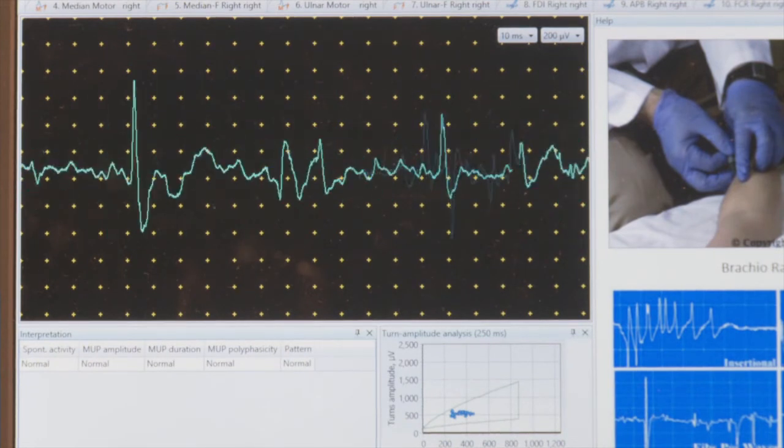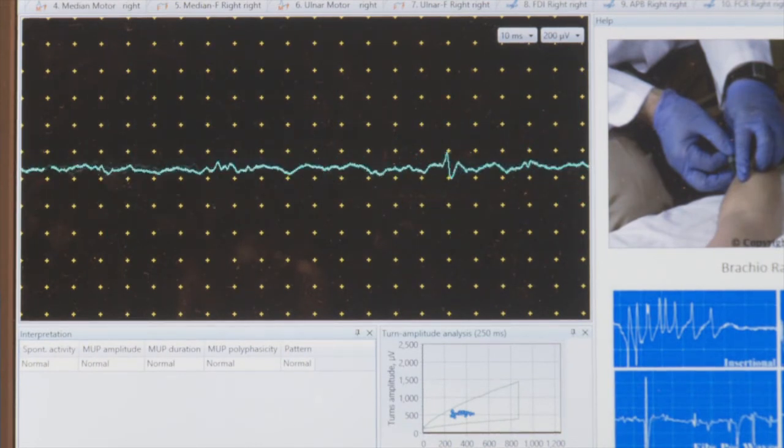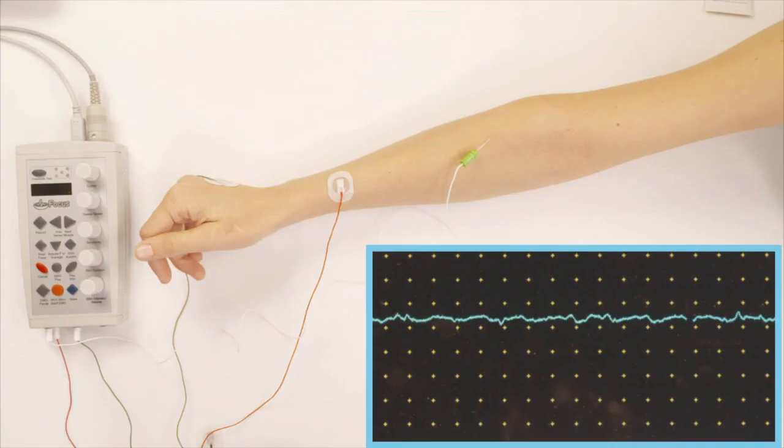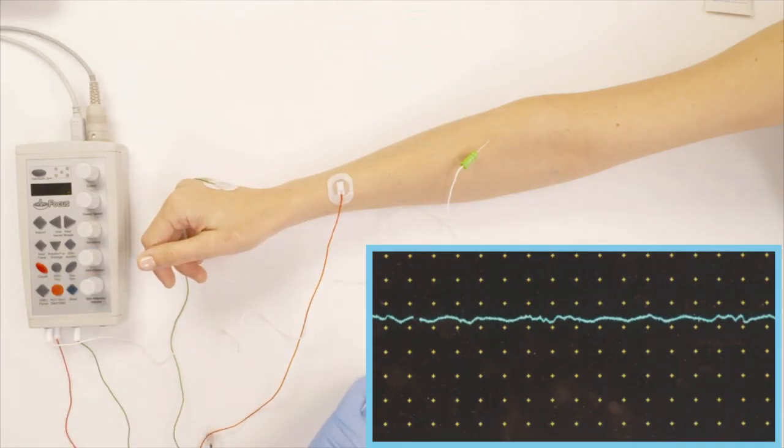And now I'm going to get full strength here. And again, all of these points are in the middle of the clouds, so they look okay. And that's the end of the brachioradialis.